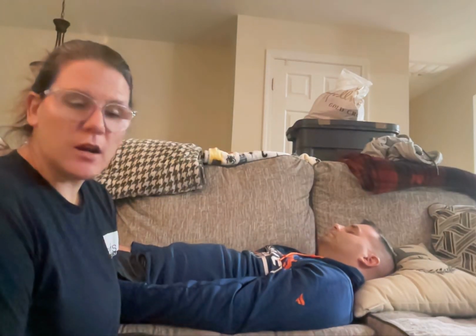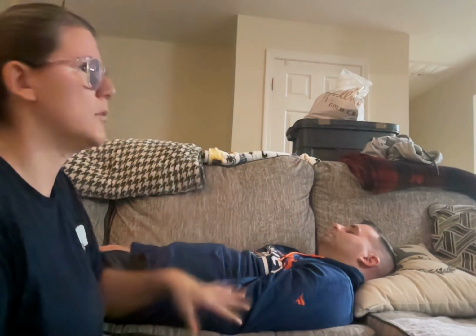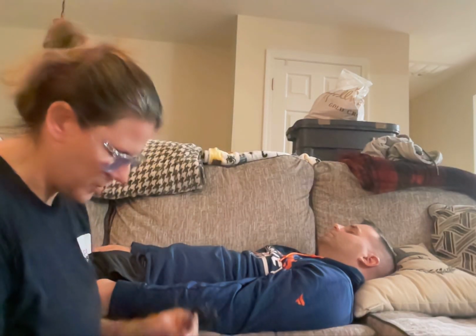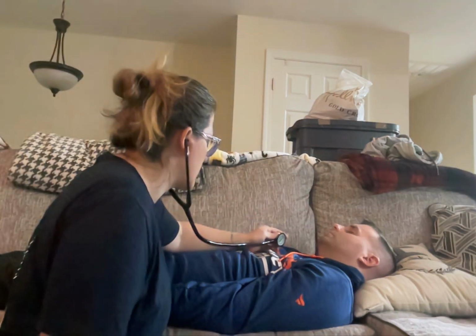Next, we're going to move on to the cardiovascular assessment. I'm going to auscultate his heart sounds while he is supine, and then I will have him go on his left side, and I will auscultate heart sounds. I'll use the diaphragm and the bell in both cases.